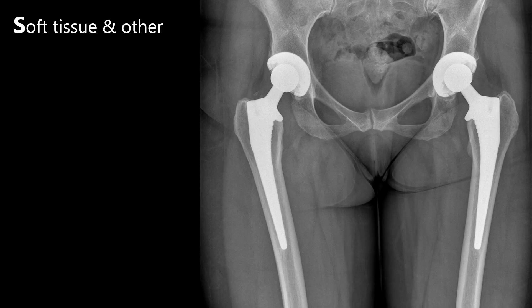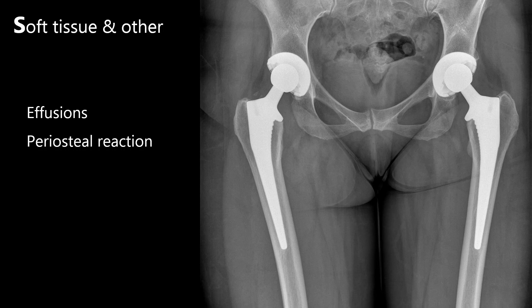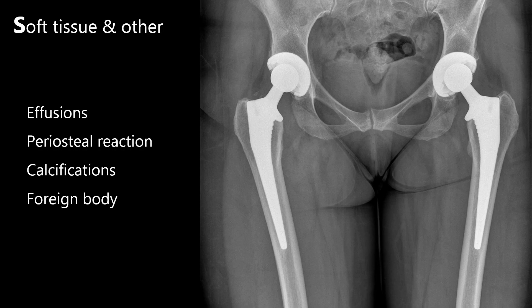To finish off our assessment, we assess soft tissue and other. Here, we're looking for any effusions, for example in inflammatory joint diseases like rheumatoid arthritis. We might also see signs of periosteal reactions, which could be a result of healing fractures or cancer. Calcifications, for example phleboliths or arterial calcifications. And foreign bodies, like you can see here in the form of bilateral total hip replacements. A total hip replacement means both the femoral head and the acetabulum have been replaced. A partial hip replacement, or hemiarthroplasty, involves just replacing the femoral head.